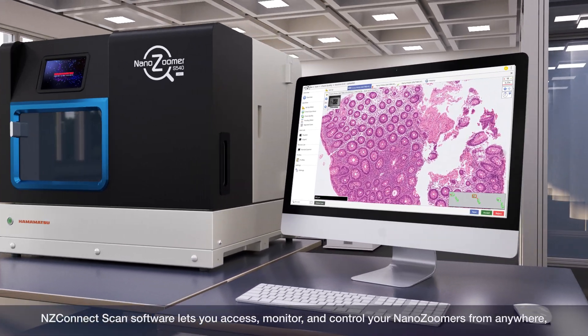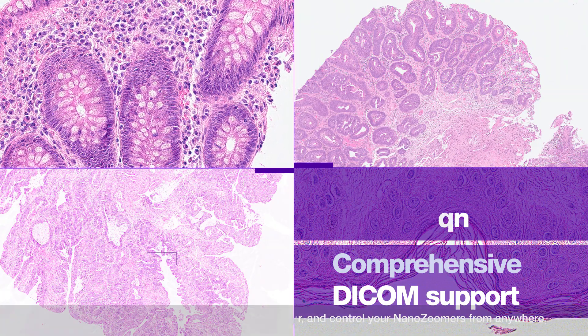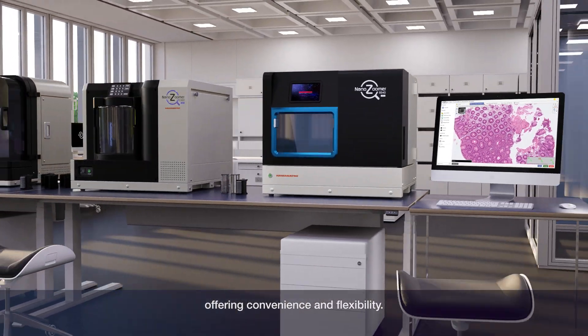NZ Connect scan software lets you access, monitor, and control your NanoZoomers from anywhere, offering convenience and flexibility.